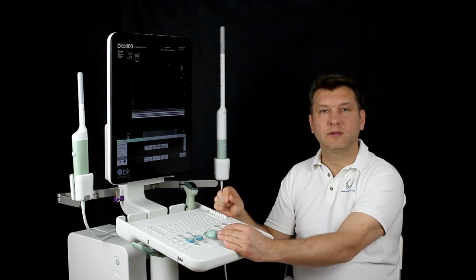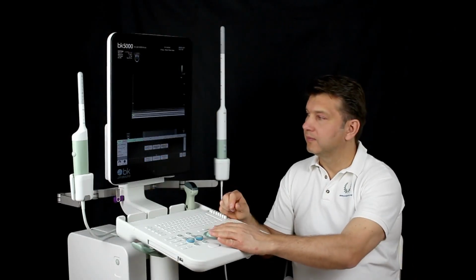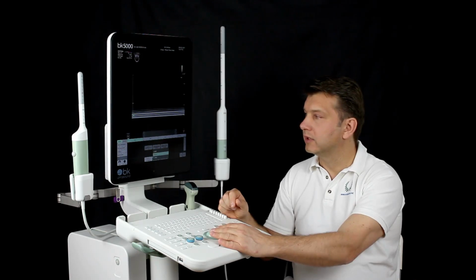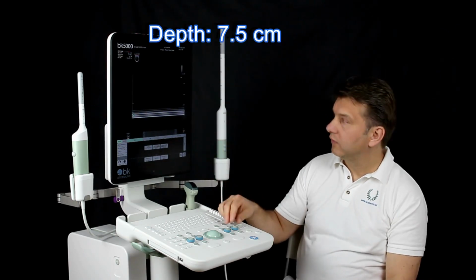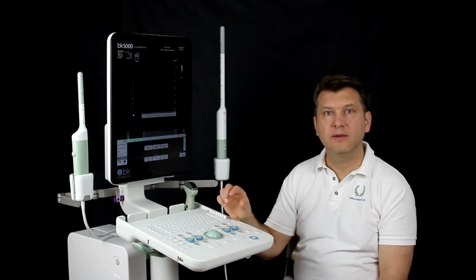For further settings we choose the following values. Frequency: here we choose 12 or 13 MHz, in this case 12 MHz. Depth: 7.5 centimeters. We can go to 8 as well.